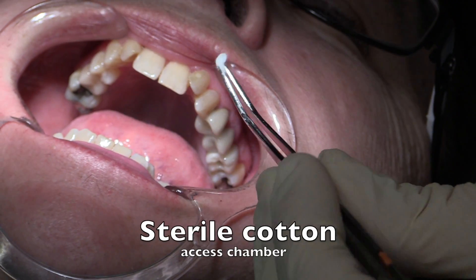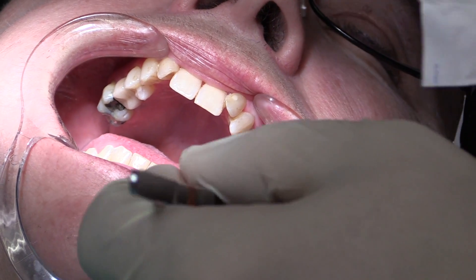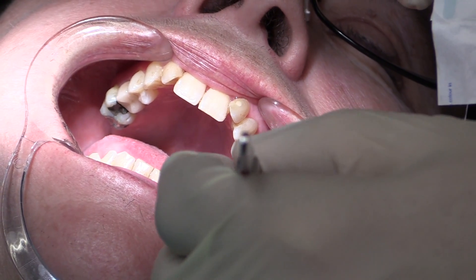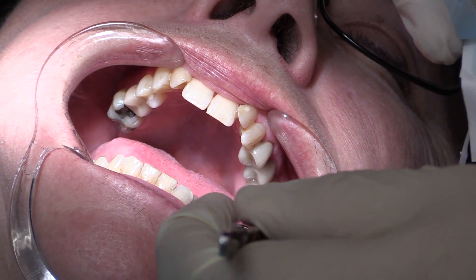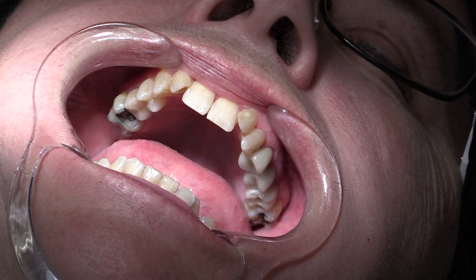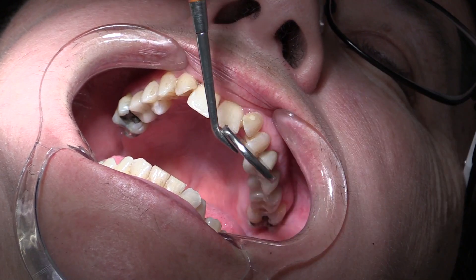This channel is usually filled in with a bit of sterile cotton, so I'm going to place a couple in just in case I ever need to get this out — I can go in, unscrew the crown, and either repair it or replace it. Repairing it, you can add porcelain to it — this is what we do with porcelain-fused-to-zirconia crowns. If you need to add to the contact or improve the occlusion, you can add porcelain.